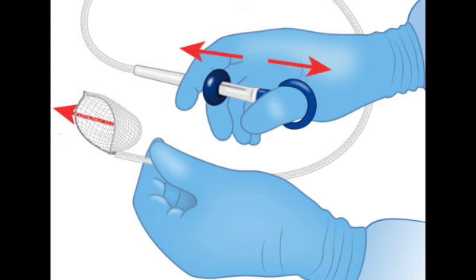But what about efficiency? Say the endoscopist is moving quickly, removes maybe 3 or 4 small polyps one after another. Right, good point. And that's where the manual procedure detail is key. If multiple polyps are removed, the person assisting has to physically rotate the chambers in the polyp trap system between each sample. If you don't rotate it, the second polyp just lands right on top of the first one. You're back to the same problem. You can't tell them apart. Potential cross-contamination. So rotating ensures polyp A is in chamber 1, polyp B in chamber 2, and so on, nice and separate.